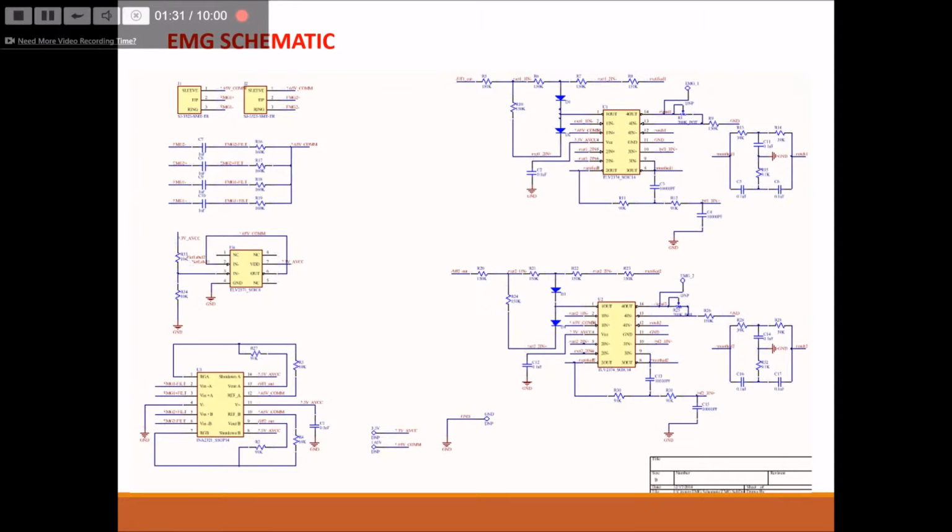So I'm going to take us through the circuit right now. On the screen you can see our schematic that we made in Altium. The main part of the circuit that you want to be concerned with is in the lower left corner. That is our instrumentation amplifier. There are two channels in the one IC. And then we have two mirrored circuits, which you can see in the upper right and lower right corners of the screen.